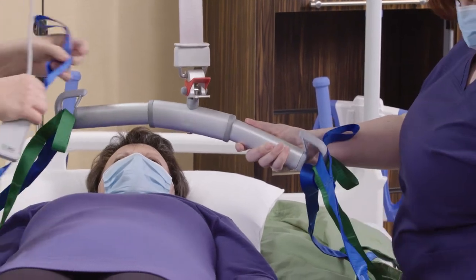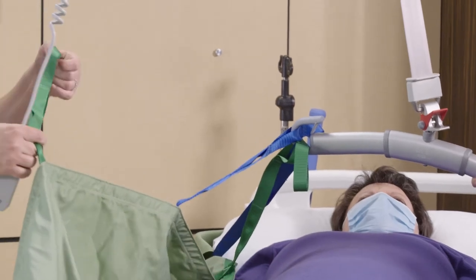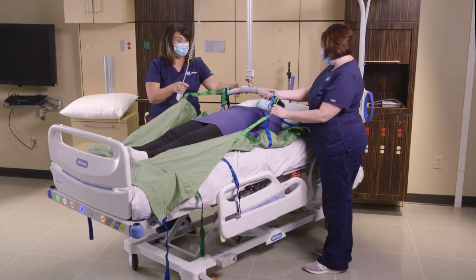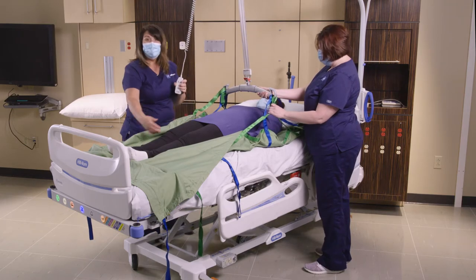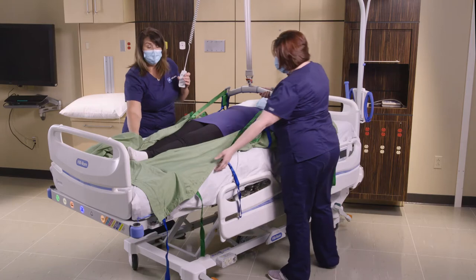Again, this is the middle loop — we're going to connect it to the sling bar. Then we go to our last loop and connect it on the outer loop to the sling bar. Once everything is secure, it's important that we don't go past the knees, because it could cause hyperextension and be uncomfortable for the patient.